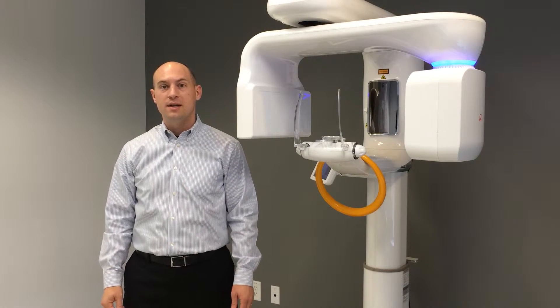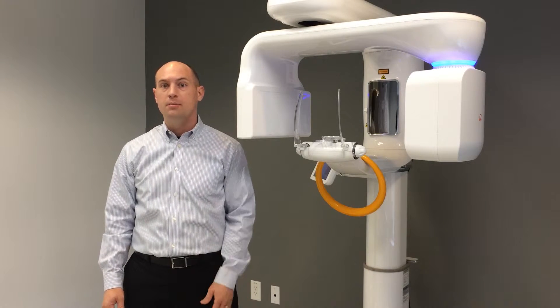I'm Wes Newsome and today we're going to take a three-dimensional TMJ acquisition using the RayScan Alpha. But before we position the patient, let's get the computer side ready first.